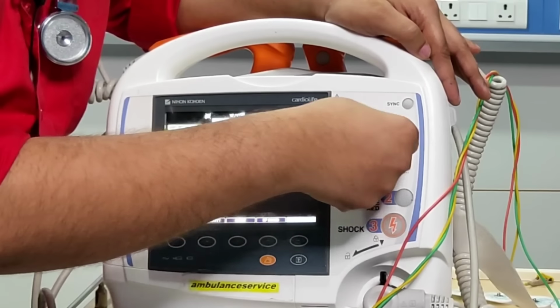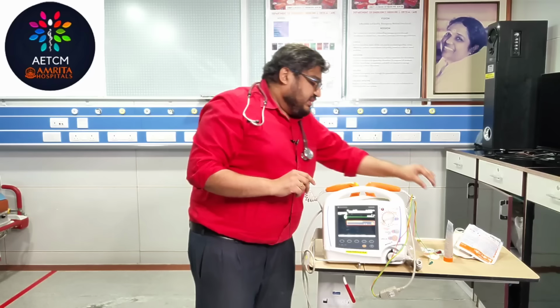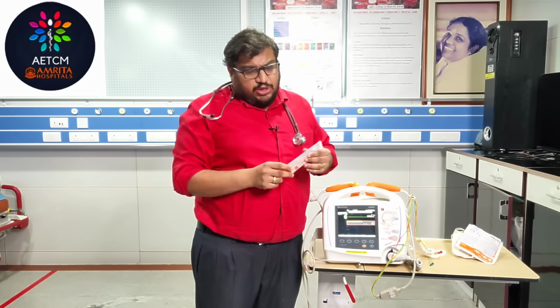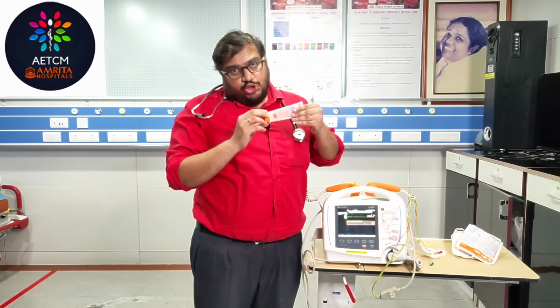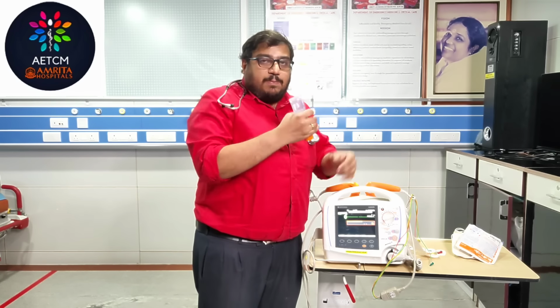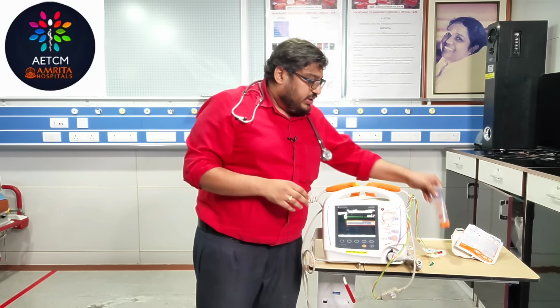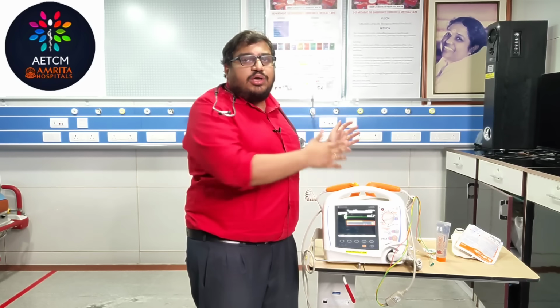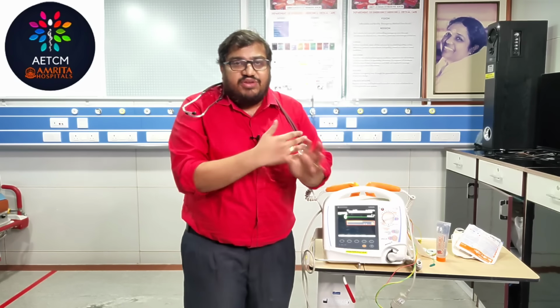So once you select the amount of energy to be delivered, then what you need to do? The next thing that you need is something called a gel aid. You have to have a gel, because you need to have a very good conduction between your paddles and the skin, and also the skin should not burn while you are giving your shock. So you need to have this gel applied between the paddles and the skin. Both the paddles you need to apply. So this is the other one that you need to arrange, and it is obvious that you should be doing this in your resuscitation area. So all your resuscitation equipment has to be there. Your monitoring, NIBP, oxygen availability, everything needs to be there.